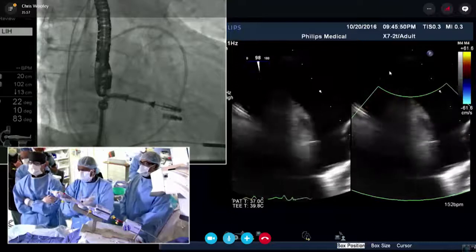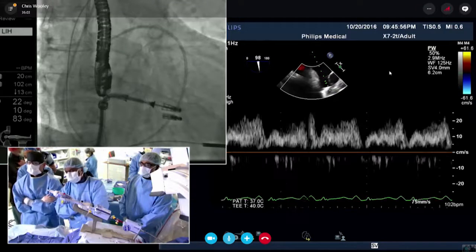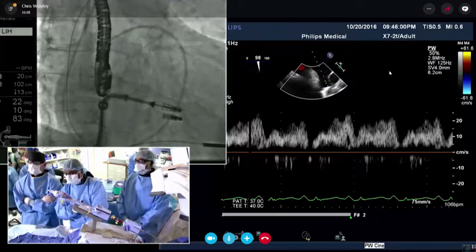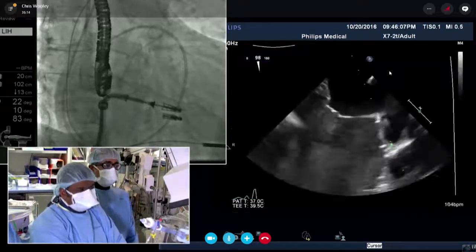That's what the patient feels. Let's go down there and look at the flow now. It's a completely different pattern. See that? I think it's systolic predominant. Is that correct? Members of the panel, am I right? Yeah, pretty equal, but yes, certainly an improvement.